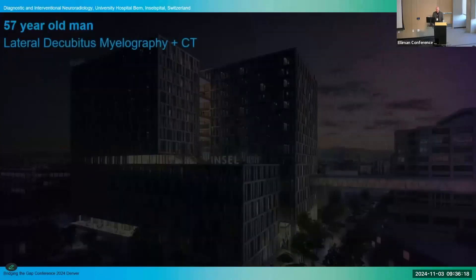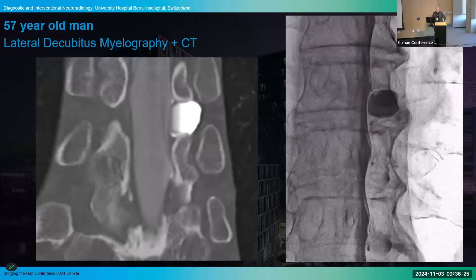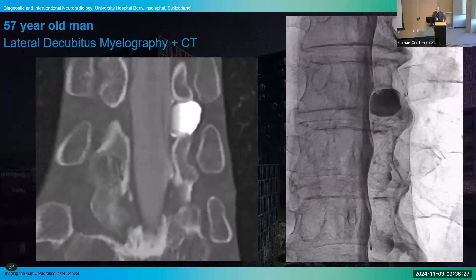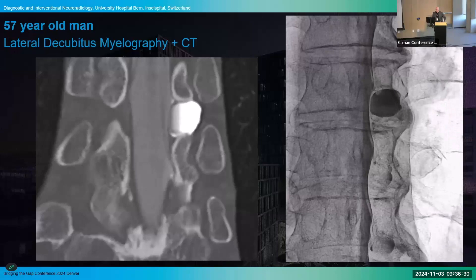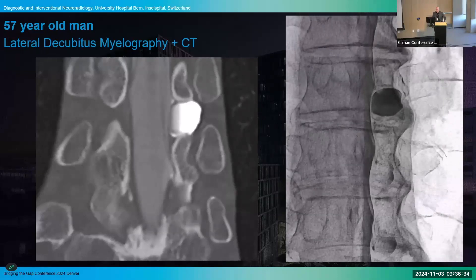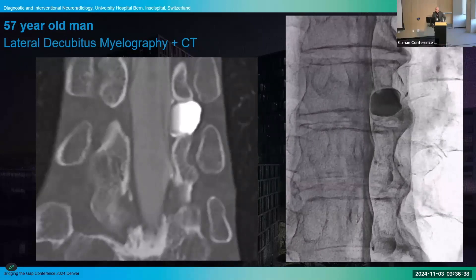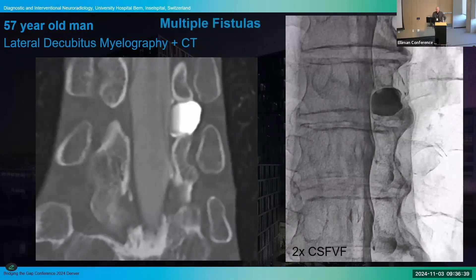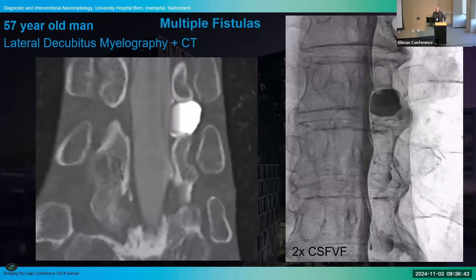Another case: a 57-year-old male where we perform lateral decubitus myelography. You can see there's a really big nerve root cyst and you can see nicely how the contrast media are running out of the cyst. But when you look closely, there's another fistula a level below — so this is a case where we have two CSF venous fistulas in one patient at the first myelography.